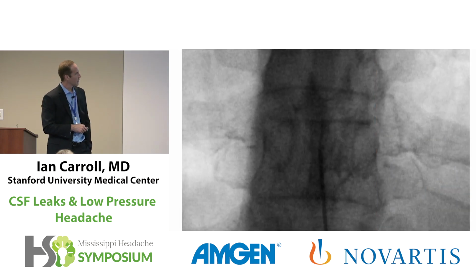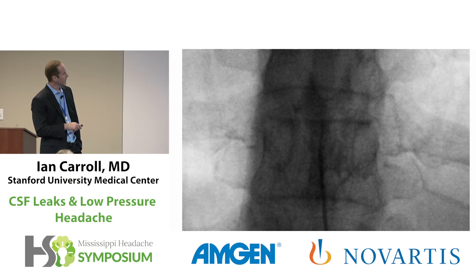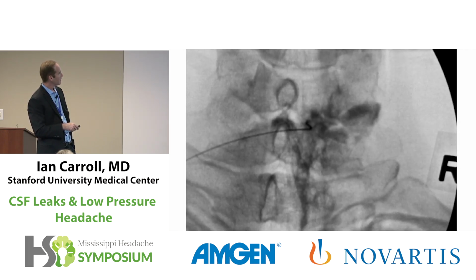This is the thoracic epidural blood patch. The needle's coming in here, injecting contrast there. And this was injecting epidural blood in the epidural space of her neck.